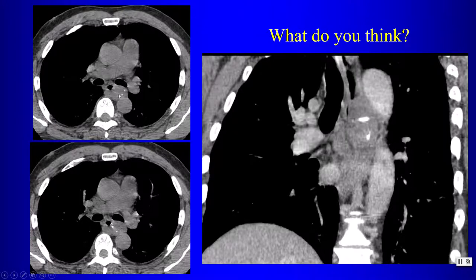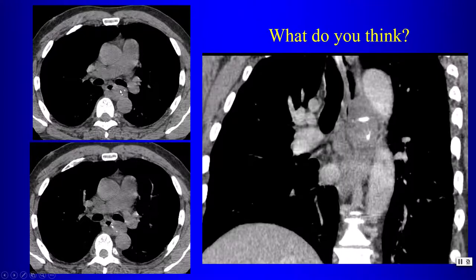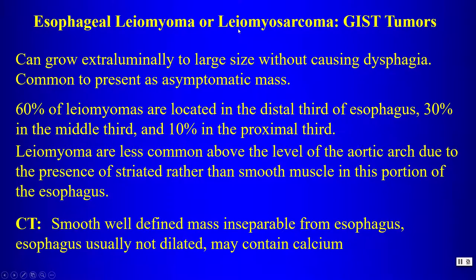Another esophageal mass with calcification: unlike esophageal cancer with circumferential wall thickening, the bulk of this lesion is outside the esophagus, with only slight encroachment on the lumen. This is an esophageal GIST tumor — formerly called leiomyoma or leiomyosarcoma — which can grow extra-luminally to a large size.